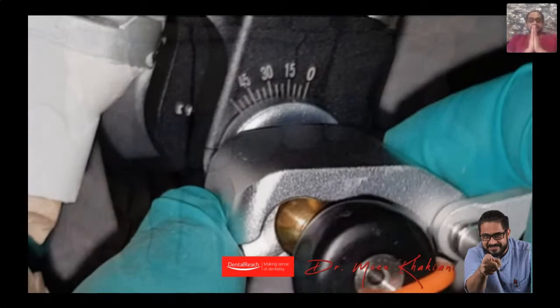And you know what the best part about H value is? There is absolutely no compulsion that the H value on the right side will be the same as the H value on the left side. Both these joints may be interconnected, but remember, they still retain their individuality. Imagine a patient who tends to bite more on one side. That patient cannot have H value on both sides that are the same. Imagine patients who walk into your practice, one side is more attrited, the other side is not as badly attrited. Again, this is an interplay of the horizontal condylar guidance angle. This area is the important area on a semi-adjustable articulator where I customize the H value.